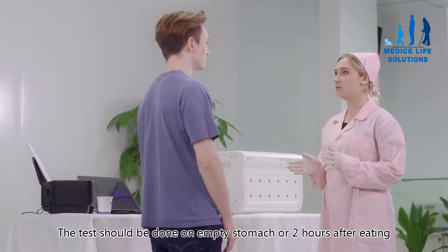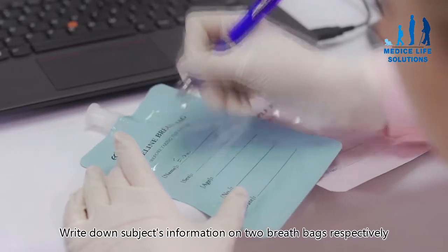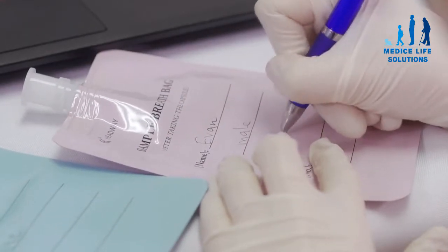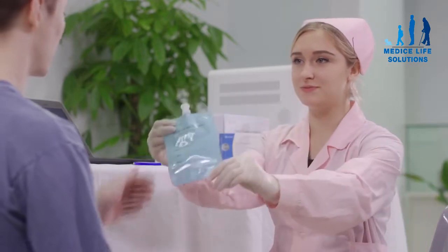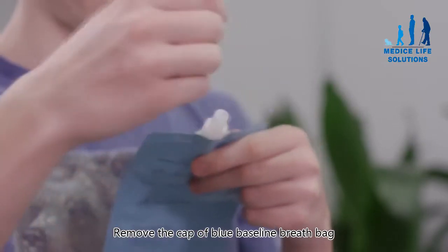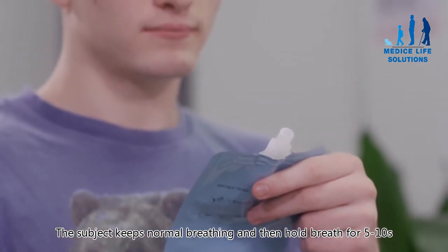The test should be done on an empty stomach or two hours after eating. Write down the subject's information on two breath bags respectively. Remove the cap of the blue baseline breath bag. The subject keeps normal breathing and then holds breath for five to ten seconds.